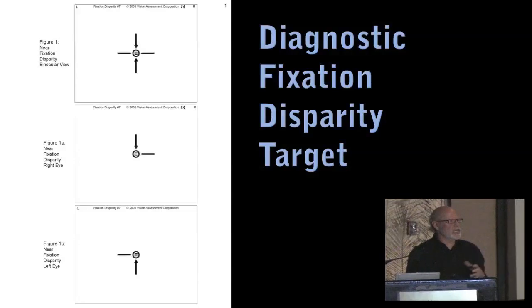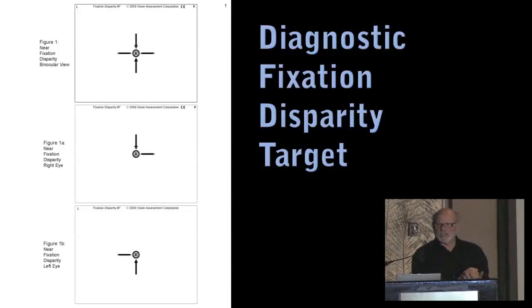I then proceed to take the Polaroid and put it over the target. And I say, you see how this starts to fade on one side? If it fades when I'm shutting down, just tell me if it starts to fade. And then I hold up the target and I say, this is straight. And then I put the Polaroids on and I begin the testing. So I just want to give you a sense of methodology of what I'm asking for an endpoint.